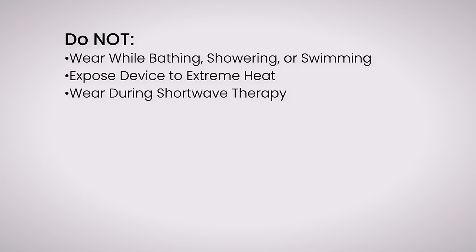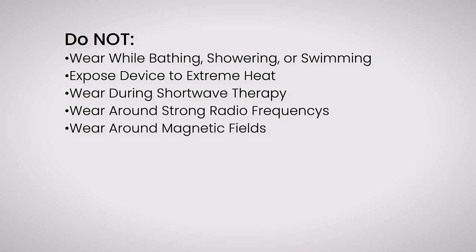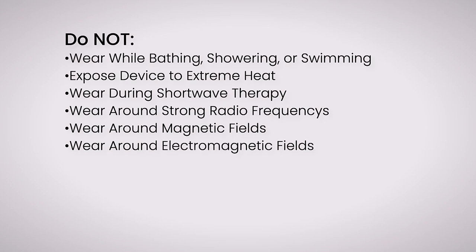Do not wear the hearing device while bathing and showering or swimming. Do not expose the hearing device to extreme heat. Do not wear the hearing device while undergoing shortwave therapy or medical treatments that are subject to strong radio frequency or magnetic fields. Do not wear the hearing device in the vicinity of strong electromagnetic fields or X-rays.